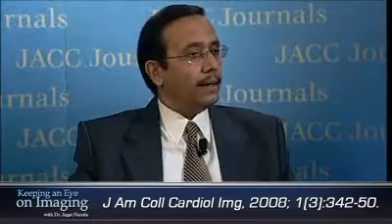And we assessed them with conventional techniques such as ABI, post-exercise ABI, and pulse volume recordings. And we determined their claudication threshold by doing a modified treadmill test to evaluate how symptomatic they were. And then we applied the contrast ultrasound perfusion imaging at rest and stress while imaging the calf muscles during plantar flexion exercise. That's a very novel way of applying ultrasound.